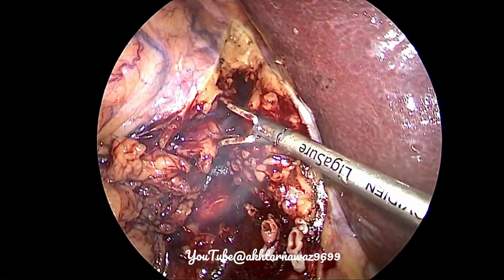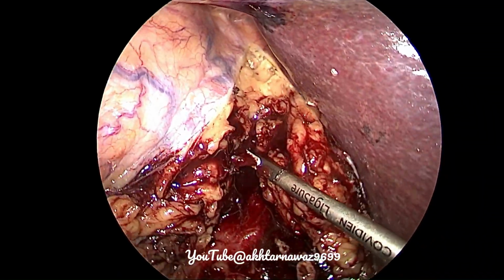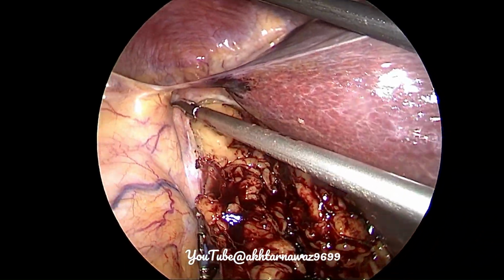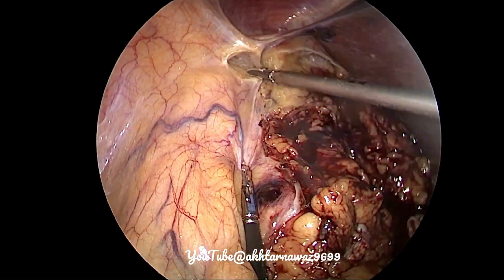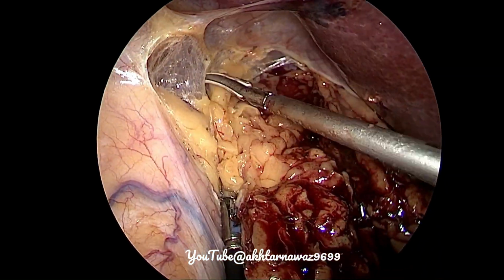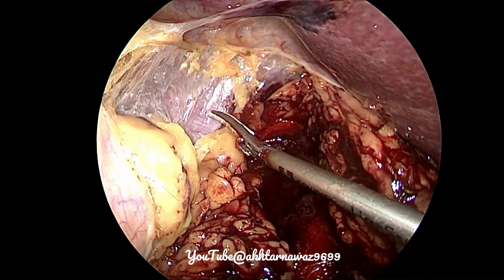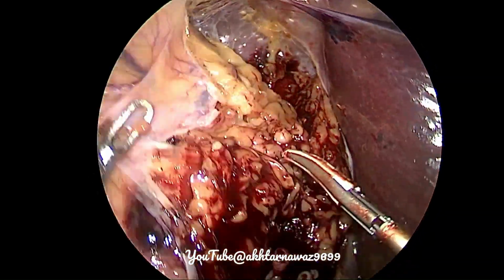Here we are sparing the adrenal gland, as there was no evidence of any radiological involvement of the adrenal vein, and the tumor was in the middle pole, so we spared the adrenal. So when we are sparing the adrenal, we usually follow the course of the upper pole after mobilizing or dividing the pedicle. So the upper pole is now mobilized.